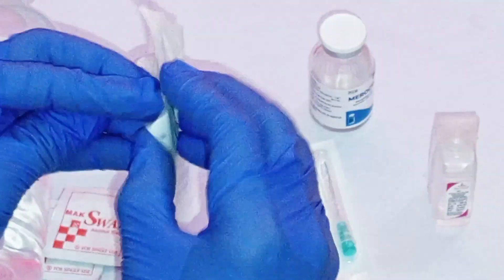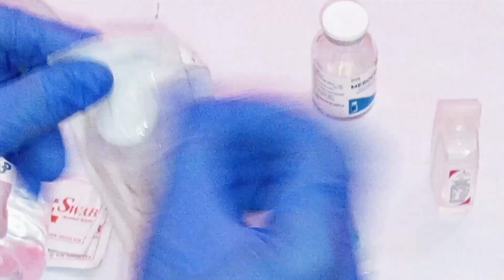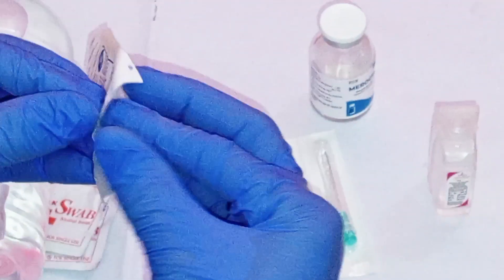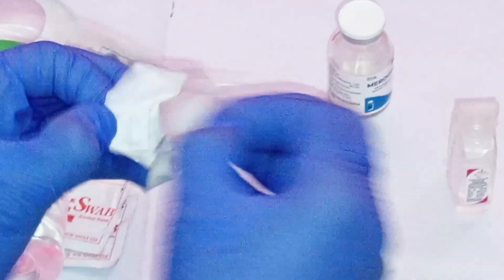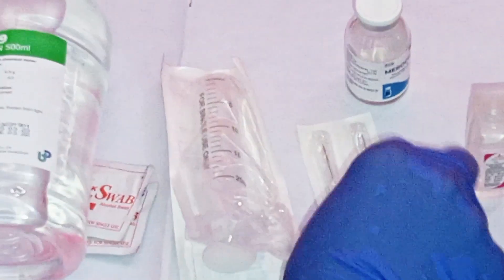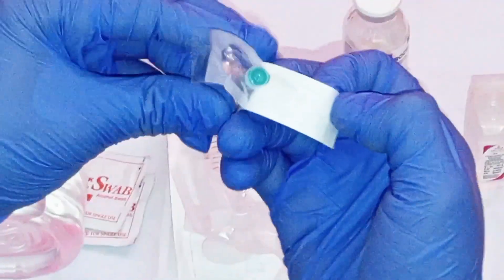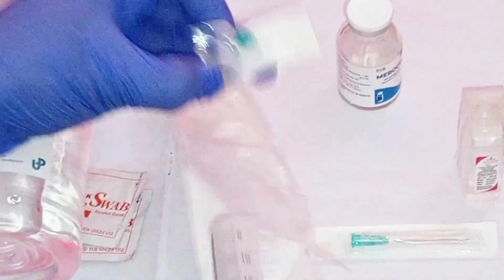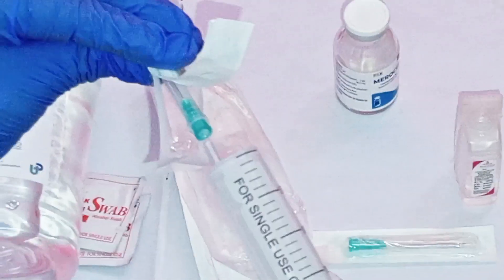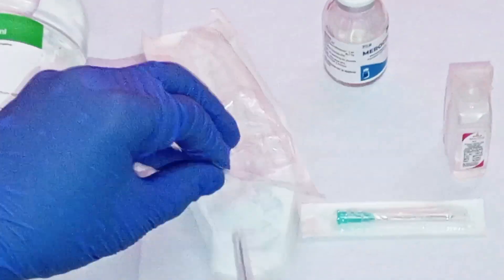First, get the syringe and remove it from the manufacturer's packaging. Place it on the working bench. Get the 21-gauge needle and remove it from its packaging. Attach the syringe to the needle, then place the syringe back into the packaging.